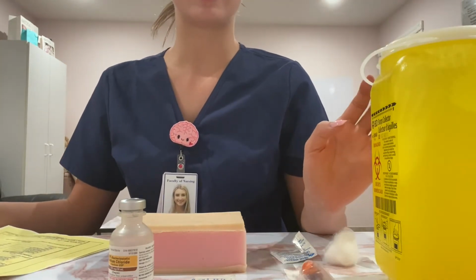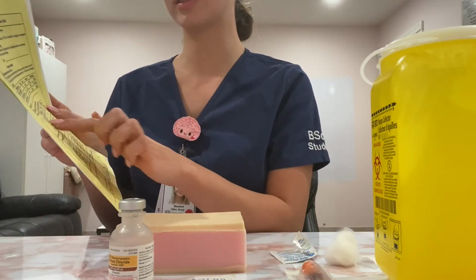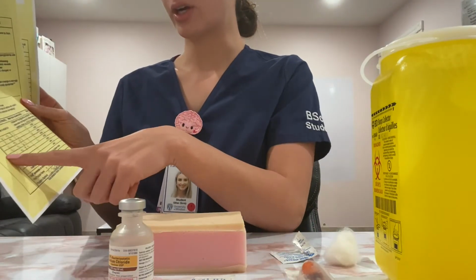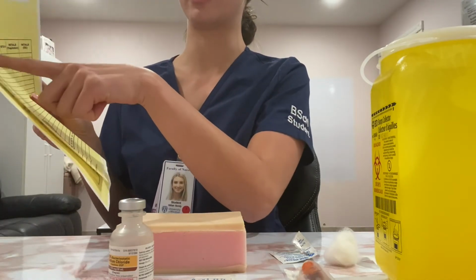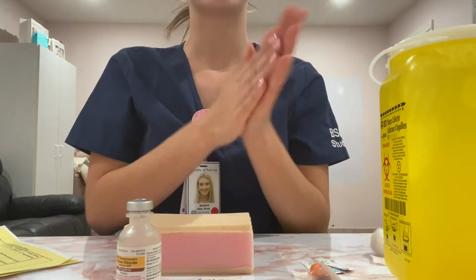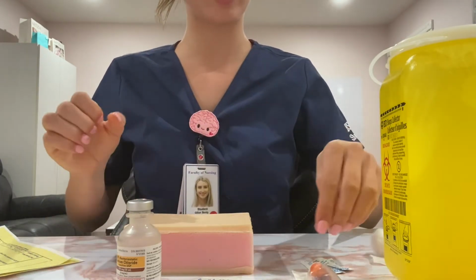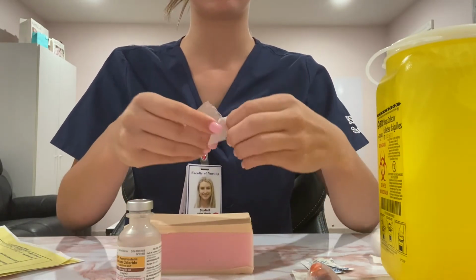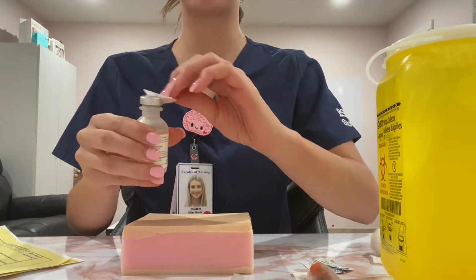Next, I'm going to calculate the correct amount, and in this case, I've calculated it to be 4 units since she's having it before supper, and then once again, I've checked that with the correction scale, and then 4 units after I've checked with the diabetic record as well. Perform my hand hygiene. I'm going to swab the top of the vial in a circular motion and allow that to completely dry.